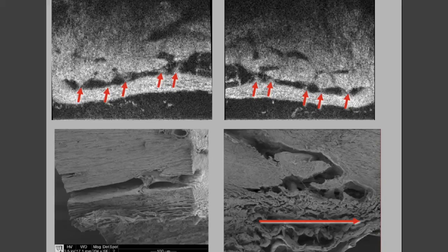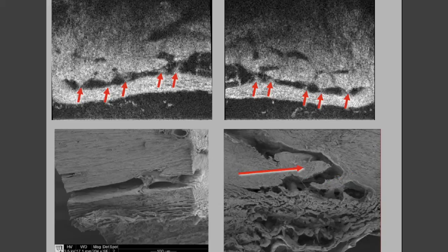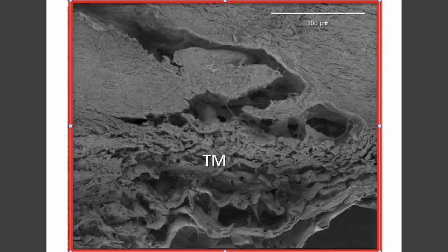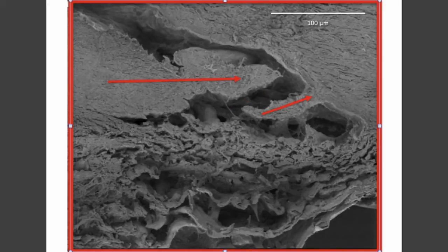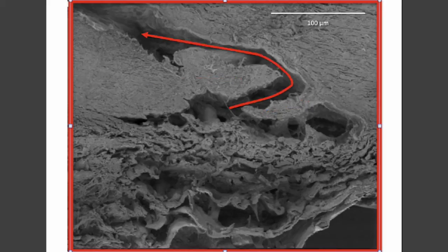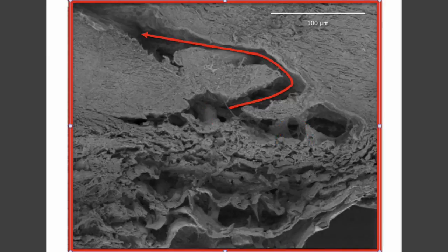Scanning electron microscopy shows the trabecular meshwork, collector channel entrance, hinged scleral flaps, and the deep intrascleral plexus which is visible on OCT as well. In more detail: trabecular meshwork, Schlemm's canal, collector channel entrance, hinged intrascleral flaps which are capable of motion because they're hinged at only one end, and the convoluted pathway of aqueous passage between these hinged scleral flaps and cylindrical attachment structures between the trabecular meshwork and the hinged flaps.